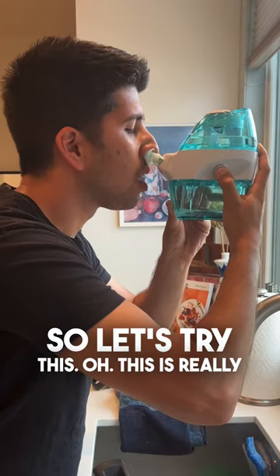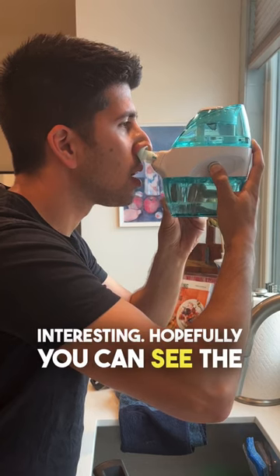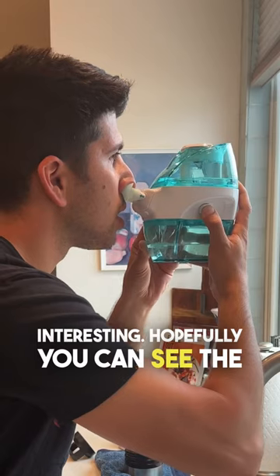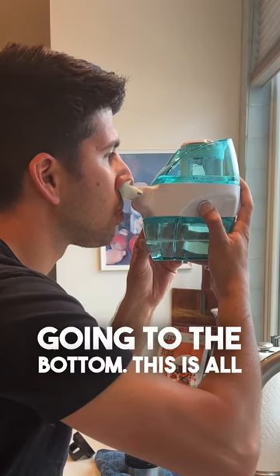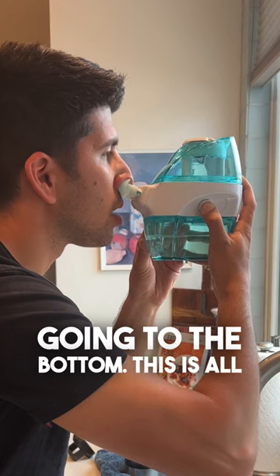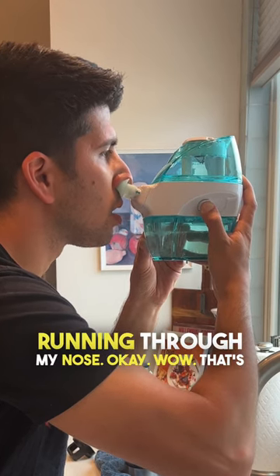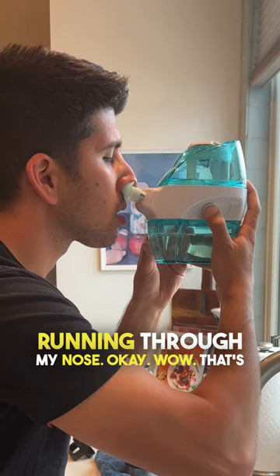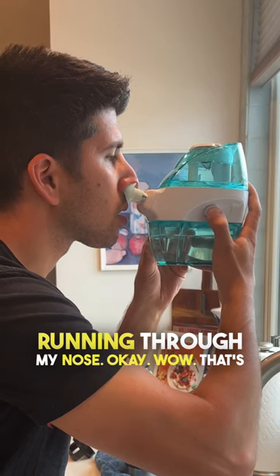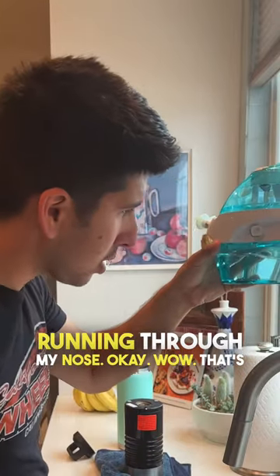Wow. This is really interesting. Hopefully you can see the water holding it to the bottom. This is all running through my nose. Wow. That's pretty crazy.